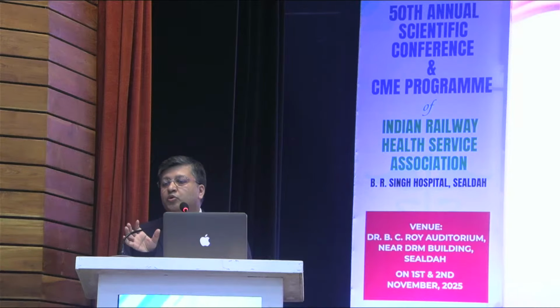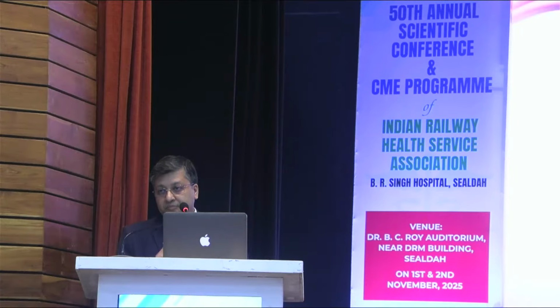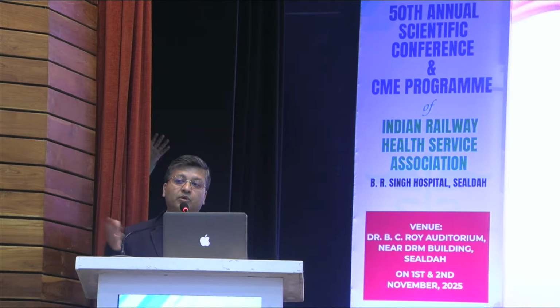The 200 joule current is equivalent to 2000 volts of discharge in 1 or 2 milliseconds, because your thoracic impedance is very high. Your thoracic impedance is 100 ohms. So to surpass that, the entire myocardium you have to depolarize simultaneously. So it is very high voltage. It is 2000 volts. Can you imagine?